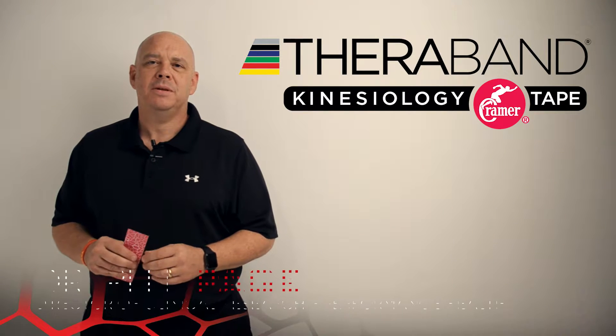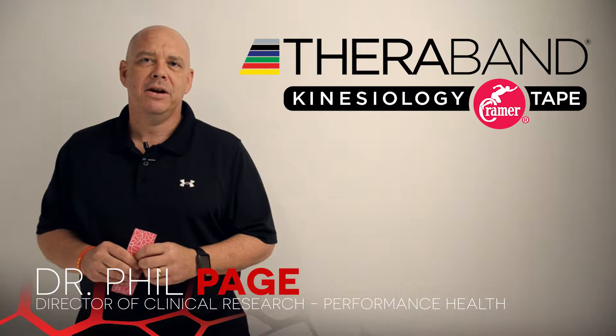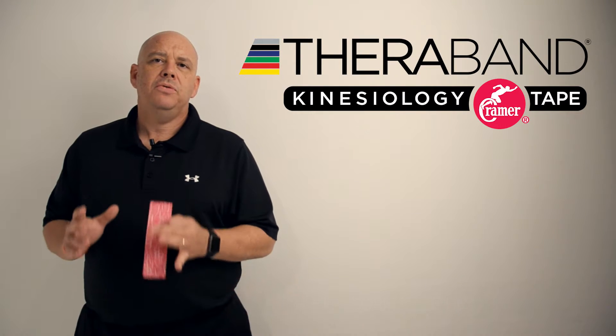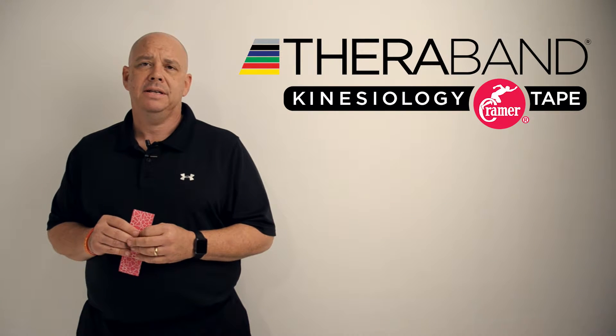Hey everyone, it's Dr. Phil Page, Performance Health. Today I wanted to talk a little bit about our new TheraBand kinesiology tape and just let you know the difference between this tape and other kinesiology tapes.